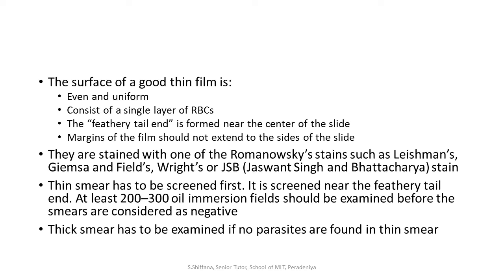Normally methanol acts as a fixative, but in the case of Giemsa, when preparing the stock solution, we add the Giemsa powder to the methanol.